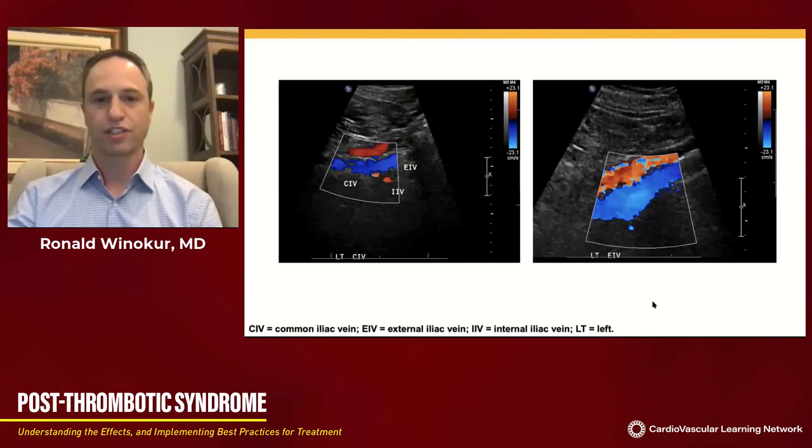And here's her follow-up. During her follow-up, I perform ultrasounds on all these patients, and so I can assess for patency of these iliac veins and of these stents. Here you can see some sample images. Here's the left common iliac, internal iliac, and external iliac stented segments with adequate central flow. And here's a little further out, the external iliac vein showing beautiful flow centrally.